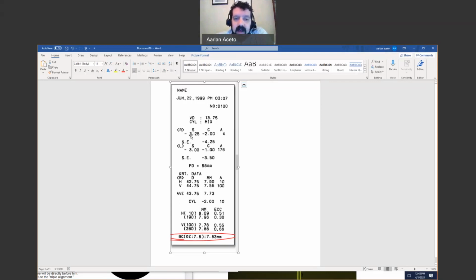You can tell me that the sphere power is minus 3.25. The total power, which is your sphere plus your cylinder, would be minus 5.25. All this stuff is things that you've been learning, but now you see these practical applications. And so it gives me an approximation of the right eye prescription and the left eye. This isn't my eyeglass prescription. This is what the doctor will use, and then start putting the phoropter, flipping lenses, and trying to see if they can fine tune and adjust and improve to make sure it's the exact right eyeglass prescription.